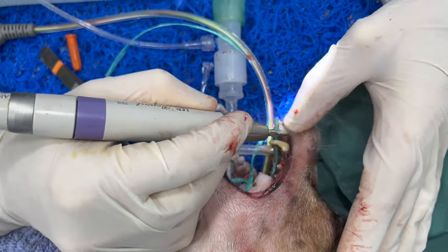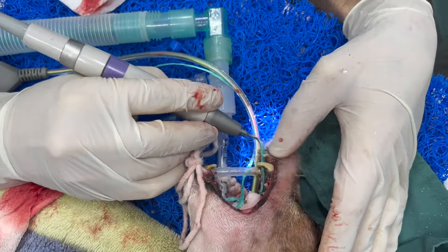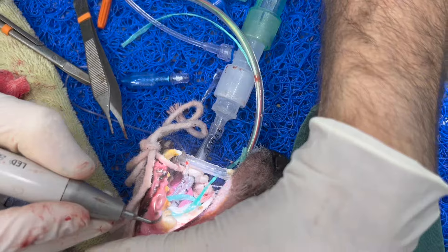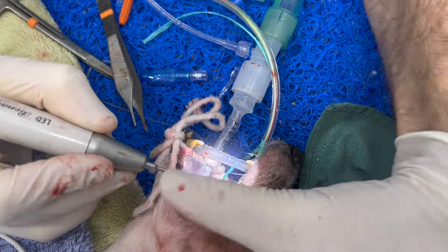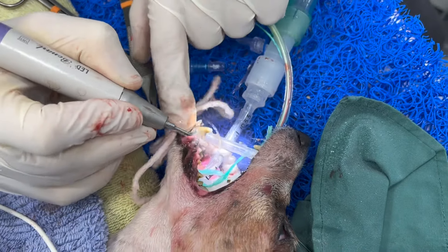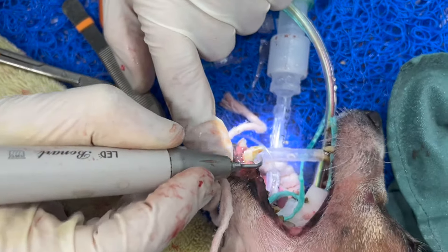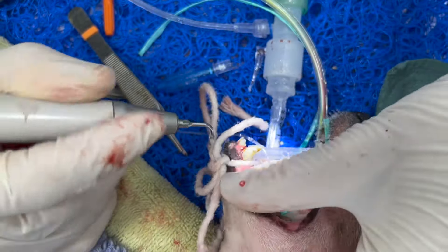This dog has multiple problems in the mouth and needs multiple extractions. A whole-mouth X-ray showed massive pathology — but this is the first visit, so for now we'll be taking out some further rotten teeth — the worst affected. This is the first time this dog has been to a vet in 14 years. We're doing as much as we can in one dental.